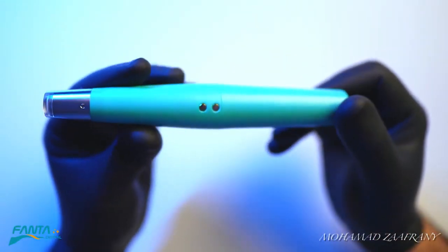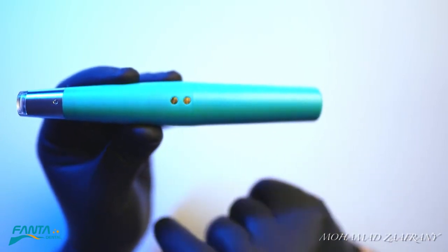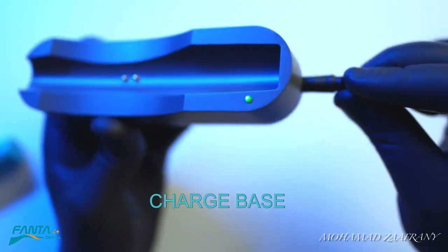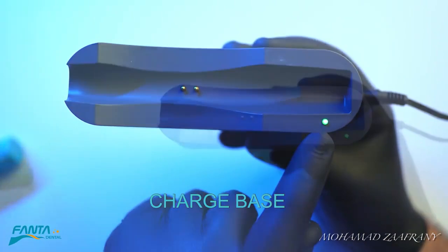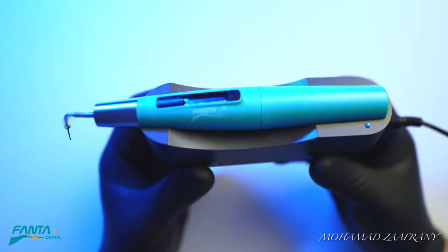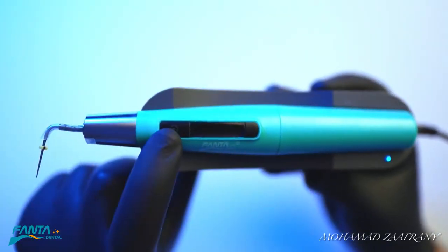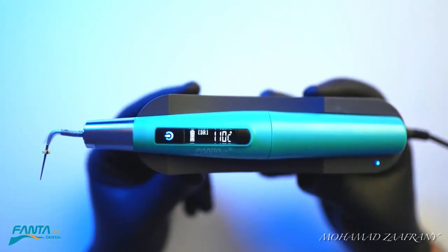On the back of the device you'll find two metal connections to fit on the charging base through two metal pins. The device has a stable fit on the base thanks to magnets that maintain the device in place. If it accidentally gets hit, the device won't operate while it is on the charger.